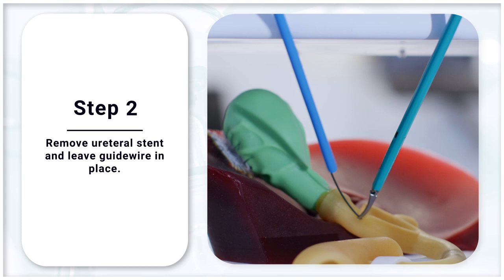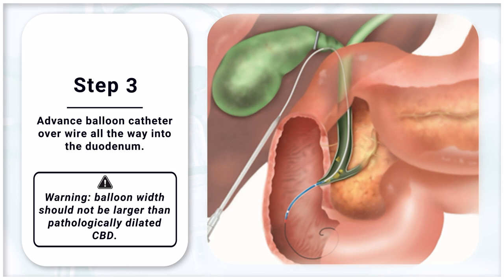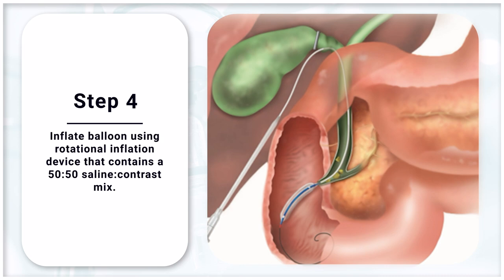Step 3: Advance the balloon catheter over the wire all the way into the duodenum. Step 4: Inflate the balloon using a rotational inflation device that contains a 50-50 saline contrast mix.